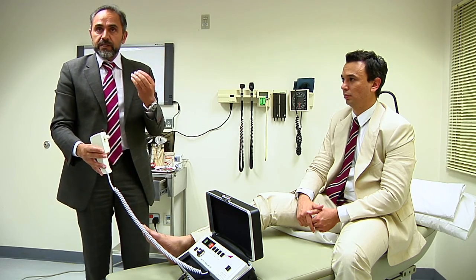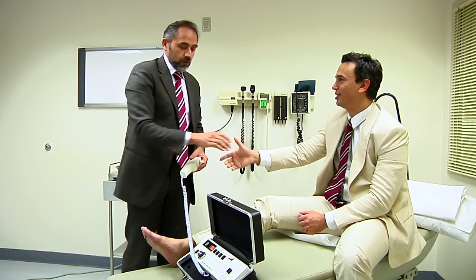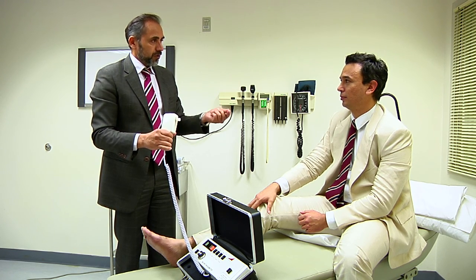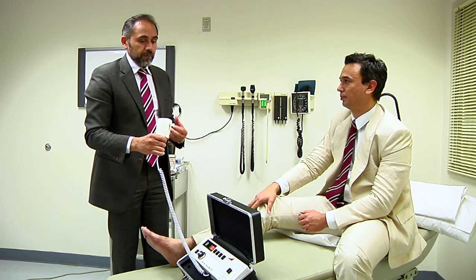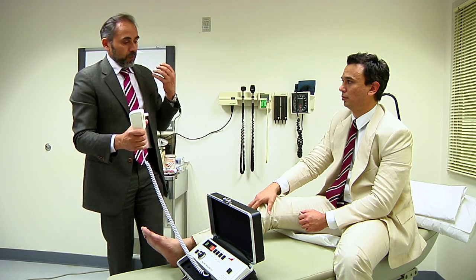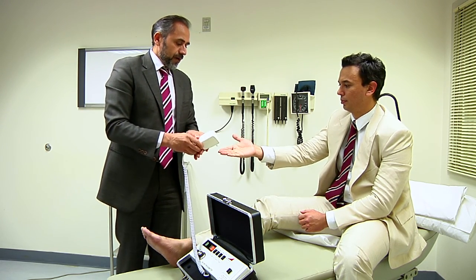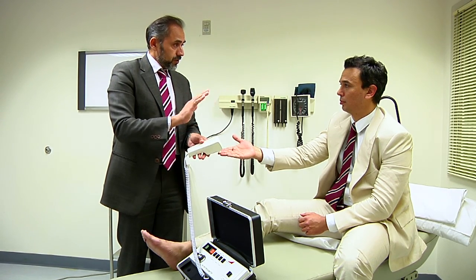And this is how easy it is. So, patient, hello George, how are you? Great. So, today I'm going to examine your feet to establish whether or not you have damage to your nerves from diabetes, if you had diabetes. Yeah. And first of all though, I want to establish whether or not you know what I'm talking about when I'm placing this instrument. So just give me your hand, just show me your finger. So if I place this on your finger, you should just feel the instrument touching you, okay?